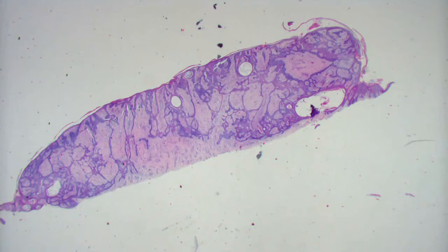Not a lot. Because I was thinking pigmented purpuric eruption. I didn't even look at that. PPPD would be, yeah, more erythrocytes. So erythrocytes, that's red. Okay, that's the cells. That was the thing that was missing. Yeah.